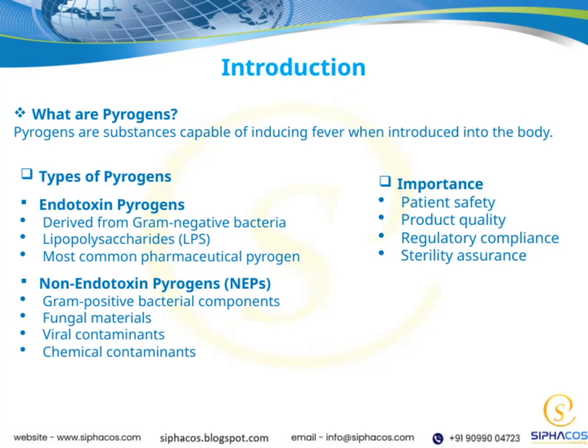Let's start by understanding what pyrogens are: substances that cause fever when they enter the body. They matter a lot because they impact patient safety, product quality, and regulatory compliance. Sterility assurance depends on controlling these pyrogens.